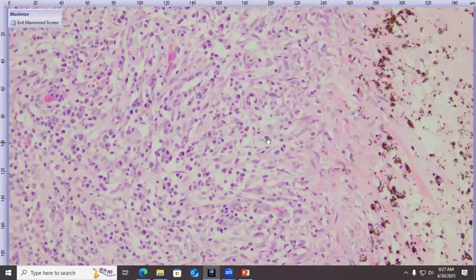And then because the inflammation is really centered on the uveal tract, it does involve a lot of surrounding structures, but most severe in the uvea. What I would favor most in this case is uveodermatologic syndrome, or VKH-like disease. There's certainly also a lot of melanin around and being phagocytized by macrophages.